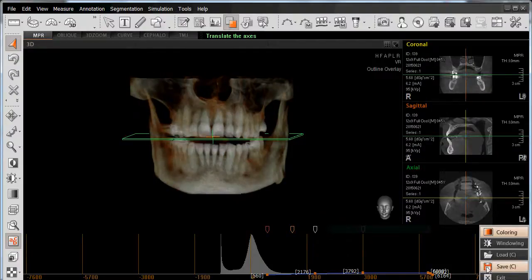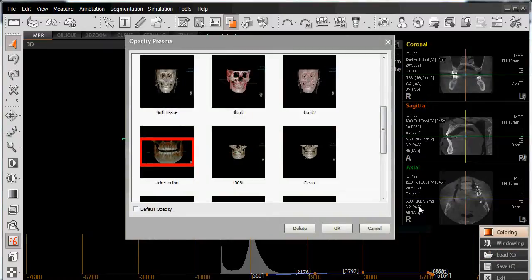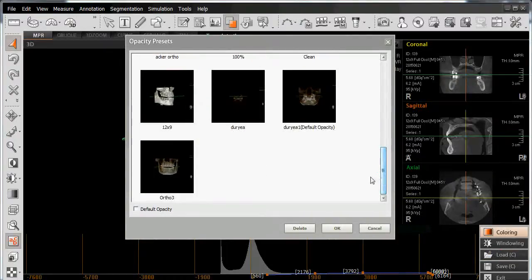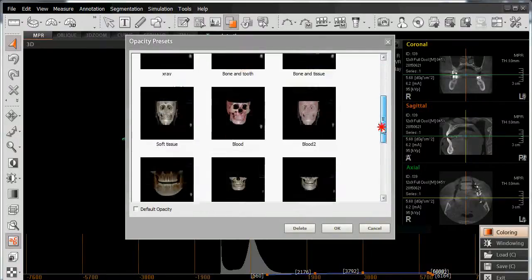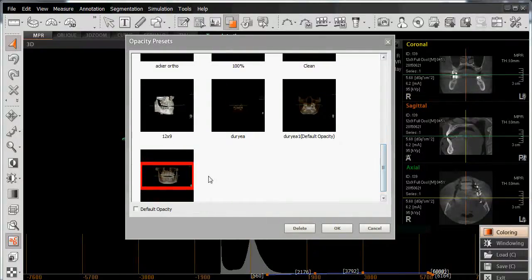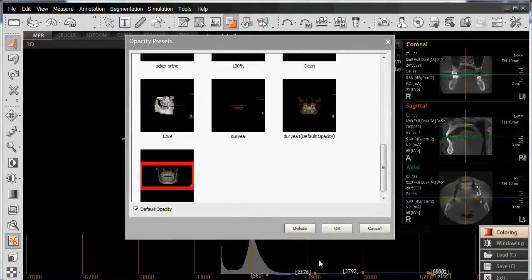To retrieve it, go to the menu and left-click on Load. Left-click on the scroll bar, and here is the opacity preset that was just saved. Through this series of opacities, you can choose one and apply it either on a per-patient basis, or place a check mark on default opacity so that each time the scan is opened on this computer, it will apply these values to that scan as well.